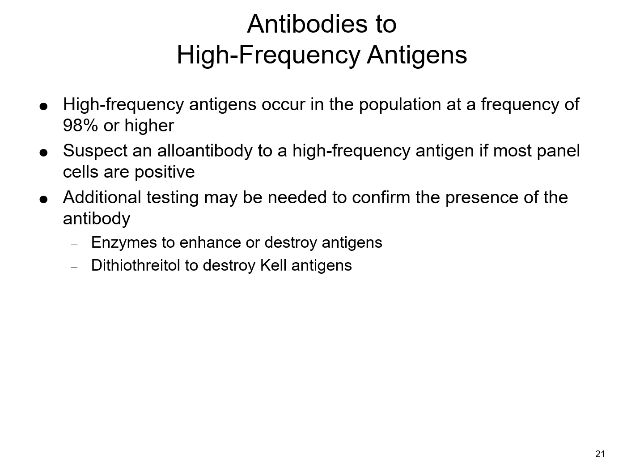Sometimes those blood centers are going to do more of this testing that's a little bit harder to do. It's a little bit more troublesome. It's very tedious testing. And given that you have to stay proficient and you may only do this a couple times a year, it's usually easier and more cost effective to send patients like this to reference labs for them to work it up, because they have better resources than most of your smaller hospital blood banks have.